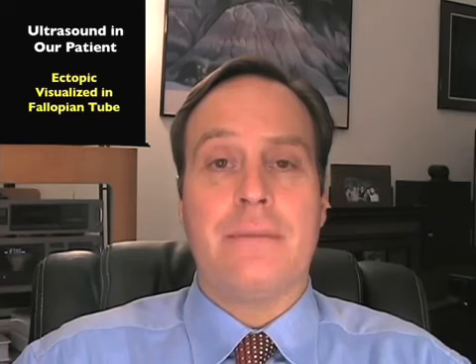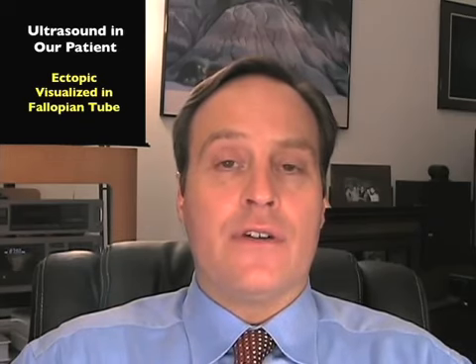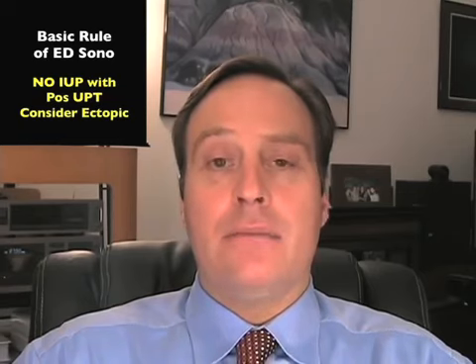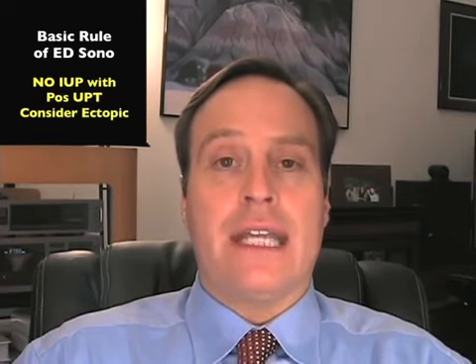What was interesting about the case was that we were actually able to visualize the ectopic on closer inspection of the adnexa. I think that's an advanced maneuver and one that you can employ when you become more and more adept at transvaginal ultrasound. But let's remember the basics: if you don't see the intrauterine pregnancy within the uterus and the beta-HCG is relatively elevated, you must get OB-GYN involved in the case.